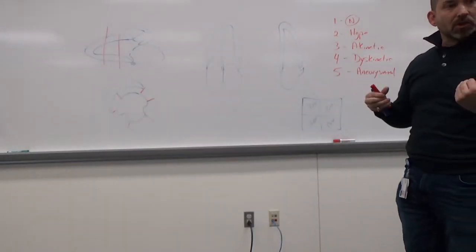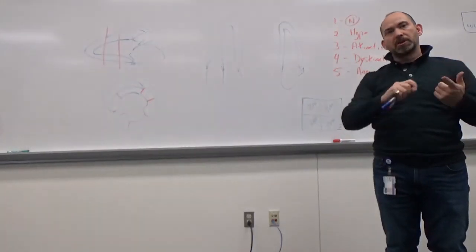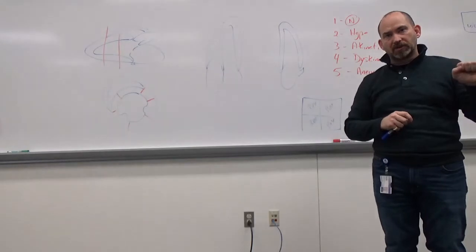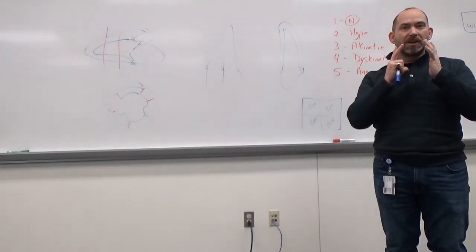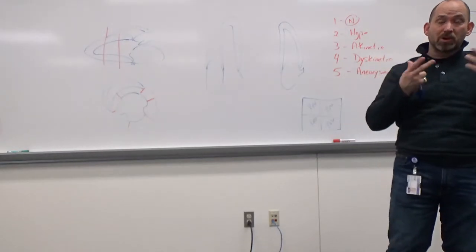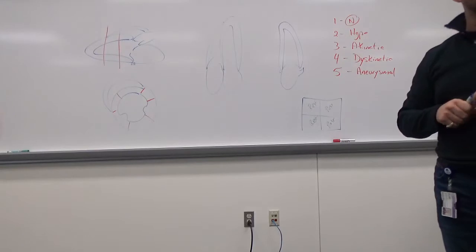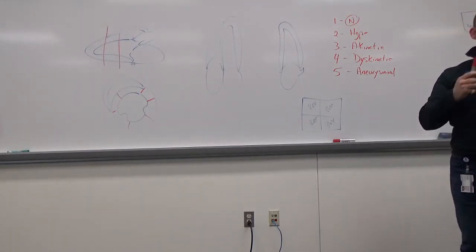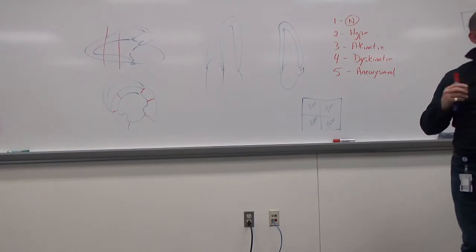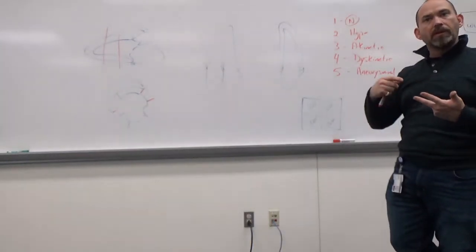The patient I told you about, I think I told you about this in EKG, when I was scanning them and I'd be scanning along and every time they held their breath their heart stopped and I couldn't get a picture. I would have stopped the test, definitely. But the doctor decided to keep pushing and do it anyway, and it turned out to be okay, but a little bit sketchy. HOCM, if somebody's got hypertrophic obstructive cardiomyopathy, that could be a risk, okay?